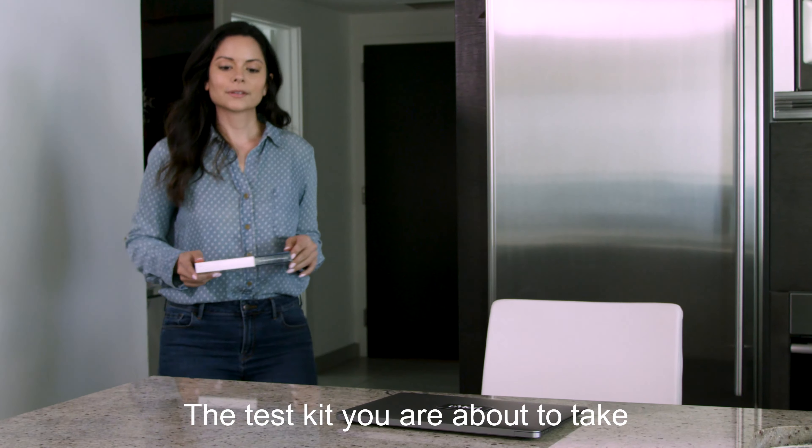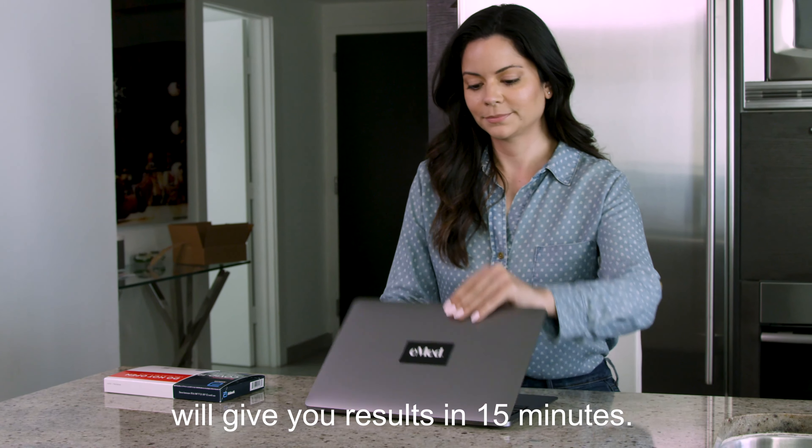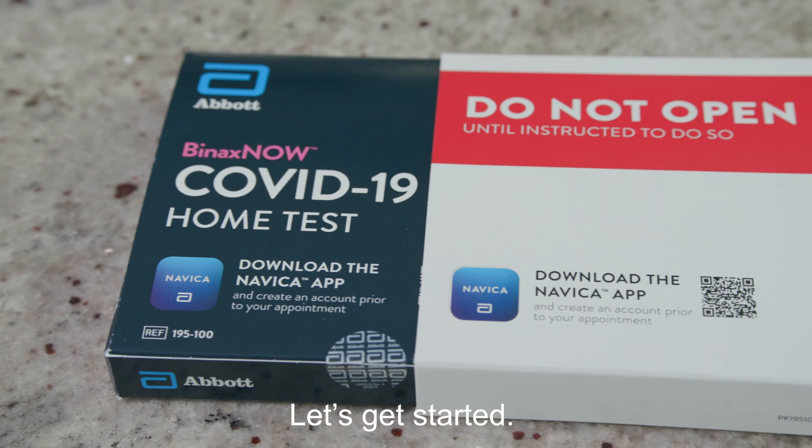Welcome to eMed. The test kit you are about to take will give you results in 15 minutes. Let's get started.